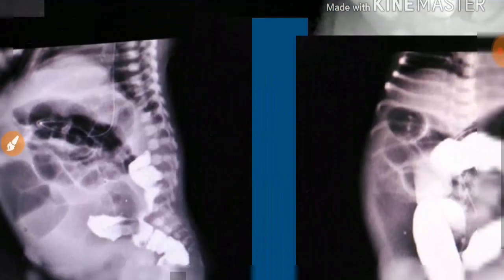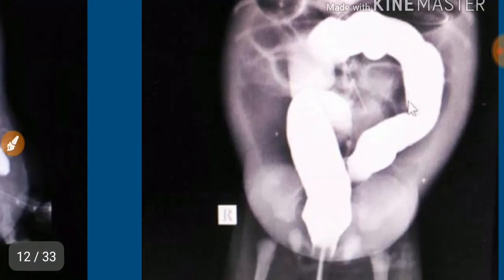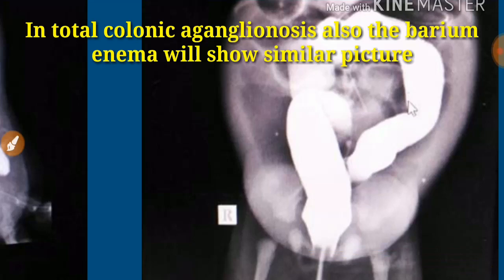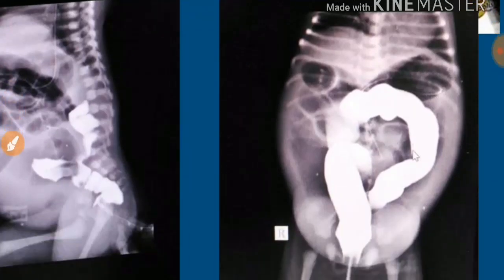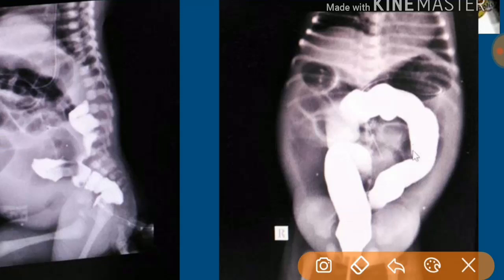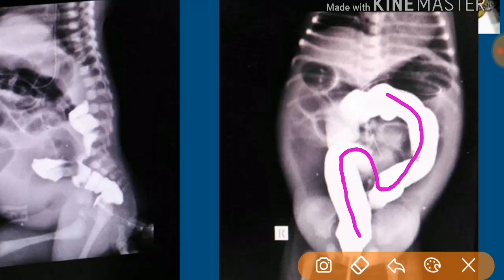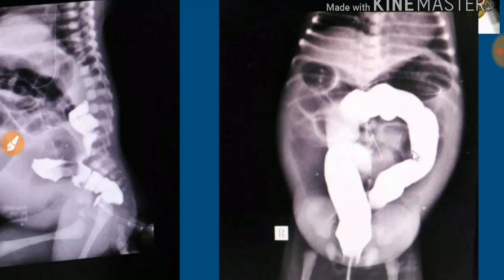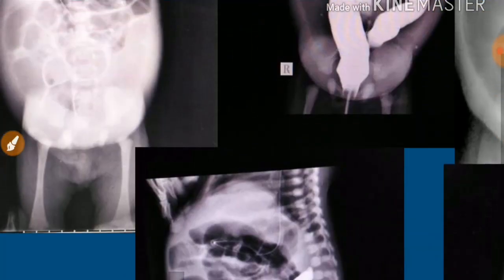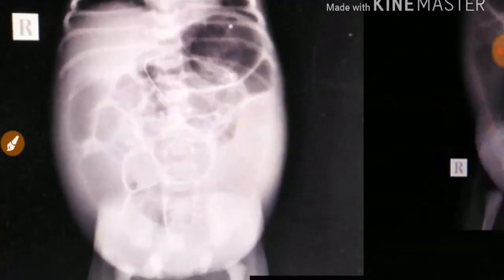We took an AP view with contrast. Normally we expect a thin, unused colon, but in this case the colon appeared large. Tracing the colon, it went in an abnormal course with a loop, and the cecum was in a different position — raising the question of malrotation. We also considered inspissated meconium, meconium ileus blocking further contrast passage, or dilatation secondary to sepsis or hypothyroidism. I put in more contrast — around 40cc — but the contrast still did not pass beyond that point.